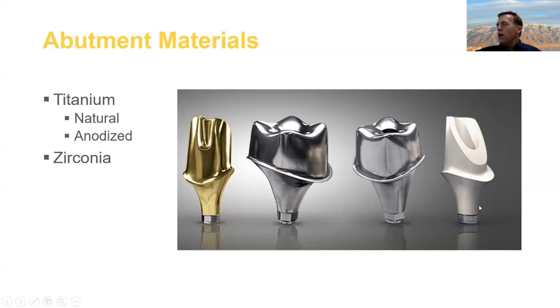Many of these, though, come with a zirconia interface down here. And with those components, every once in a while, these will break. If this breaks, it's a nightmare. The good news is you get to remake the whole thing, which doesn't sound that good. The bad news is once you get the screw out, you've got to fish all these little fragments of interface out of the implant. And if you don't get them all out, then it's going to keep all your other parts from seating. They're a real pain in the behind.